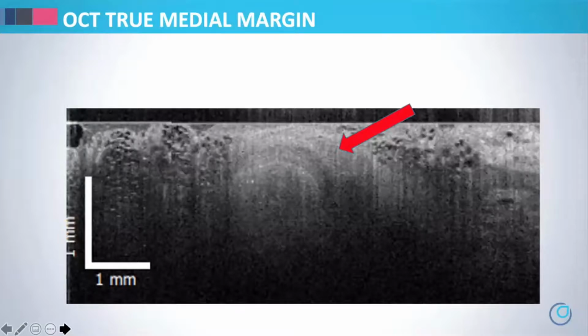So my first specimen was a large, approximately, I believe, a 200-gram lumpectomy. It was the entire upper central portion of the breast. So each additional margin was another centimeter of tissue. So this second centimeter of tissue, clearly I could see that there was this abnormal duct.